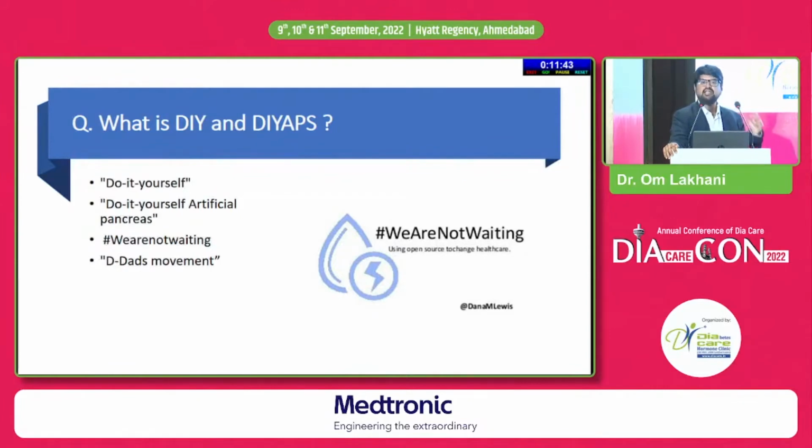But the second challenge is that the speed of development of these devices is extremely slow. And you can understand why, right? So anybody who has had any correlation with any pharma company, how much time it takes for a drug to develop, right? You have the phase 1 clinical trial, phase 2 trials, phase 3 trials. The same amount of time takes for a device also to develop, right?